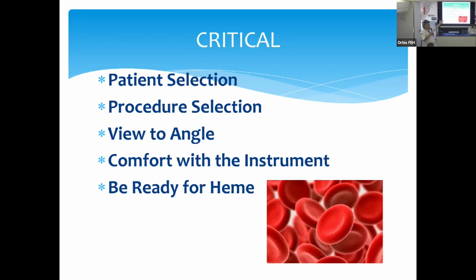And then, of course, you have to pick which procedure for which patient. I have a handful of MIGS that I like the most. They make sense to me. And given the kind of patients I see, I don't do eye stents because I don't really have mild glaucomas. Those people don't come see me. They're in a general ophthalmology clinic somewhere. They're not coming to see the glaucoma specialist worrying about going blind. They're just getting a little quality of life: oh, I'll take you off one extra medicine. We got your ALT, SLT, and then a little stent. Maybe you'll be on fewer meds. It's for the mild patients. So you're going to pick different procedures for different patient groups, depending on who comes to see you, what you feel comfortable with, what you have available, and so forth.